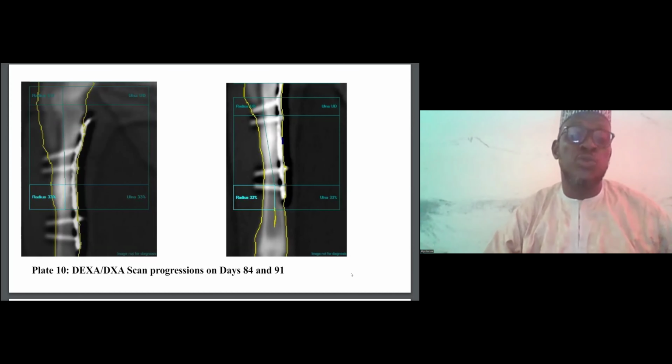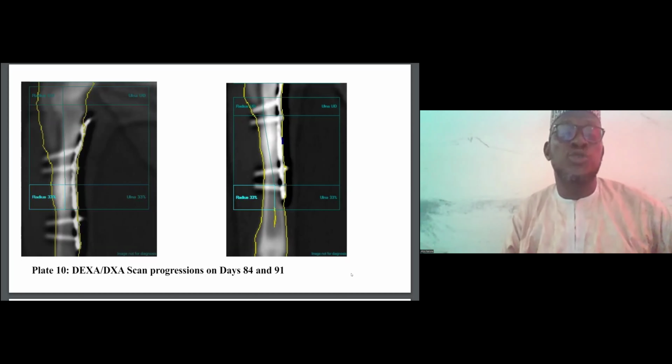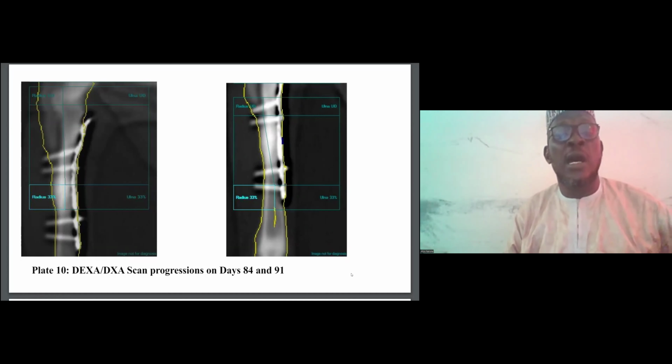So most times, women or animals of old age that must have attained postmenopause are at risk mostly of osteoporosis. So they are the candidates for this DEXA machine, the good candidates for the DEXA machine. They could be scanned and they could stand either at osteopenia, they could be normal, or have issues with osteoporosis.